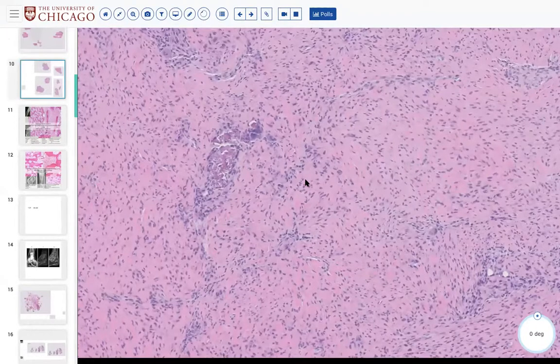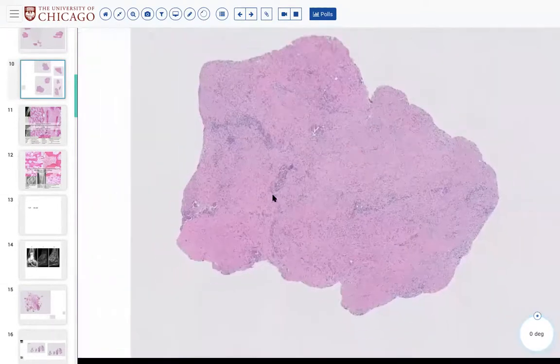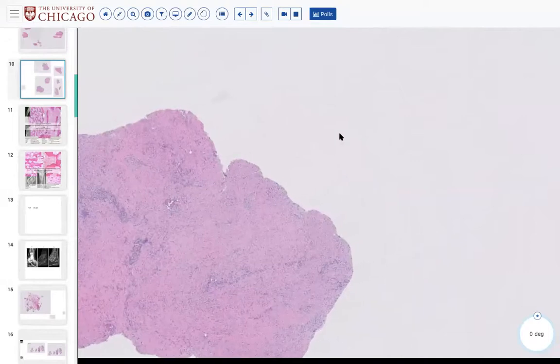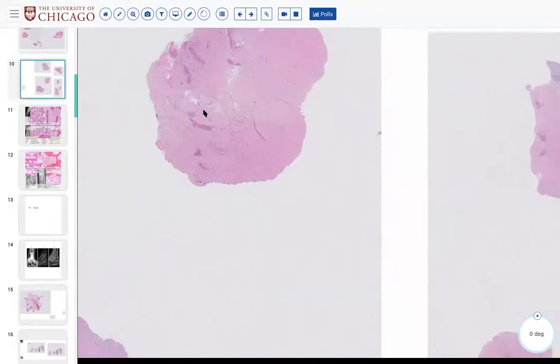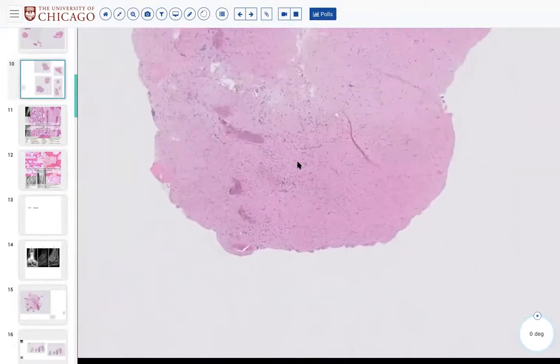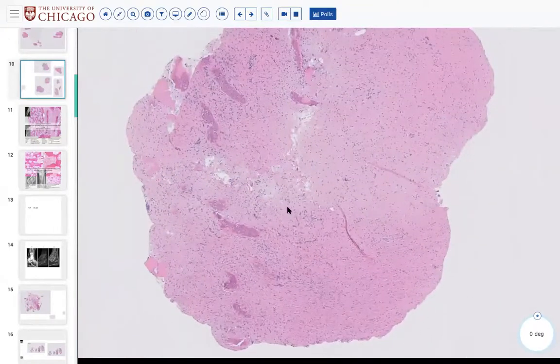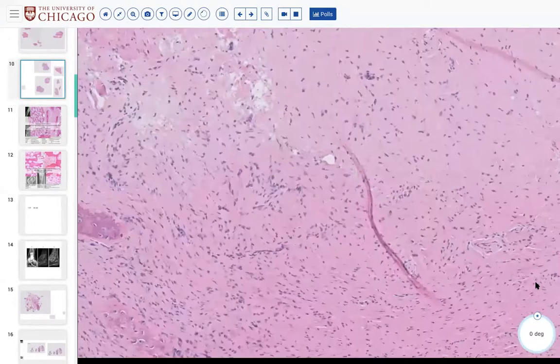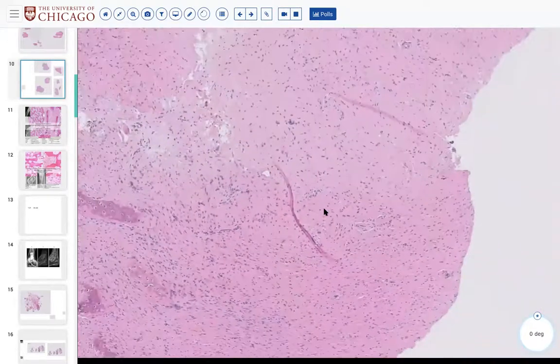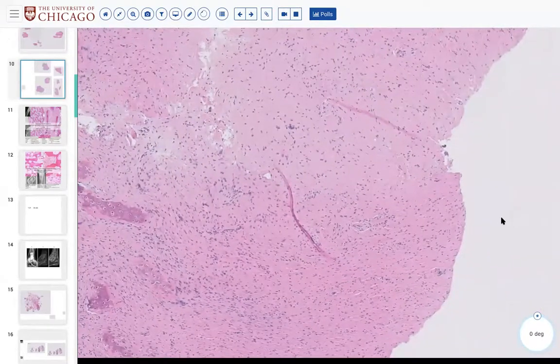I will point out that of the things that you have discussed, the diagnosis here is going to be fibrous dysplasia. When you think about a fibro-osseous lesion of bone, you guys all picked out some good differentials that come to mind. I'll start with non-ossifying fibroma.